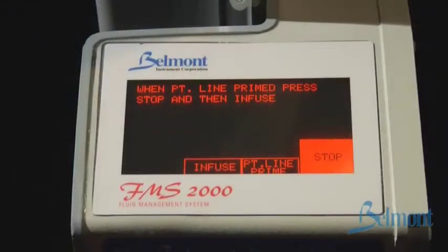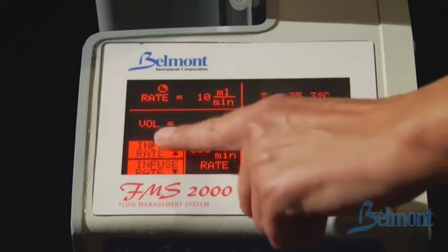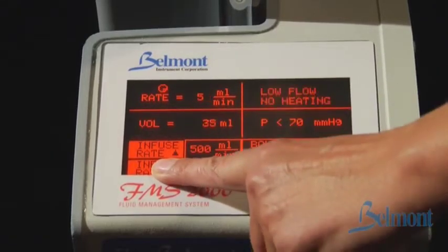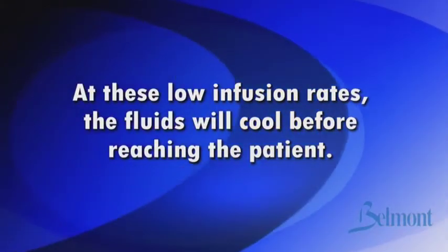Once the system is connected to the patient, press infuse to begin operation. Infusion will automatically start at 10 milliliters per minute. The infusion rate, total volume infused, temperature of the fluid being infused, and the pressure within the system are continuously displayed on the display panel. Press the up arrow to increase the infusion rate; press and hold to change the rate quickly. Press the down arrow to decrease the infusion rate. Note: at the infusion rate of 2.5 and 5 milliliters per minute, the fluids are not heated. At these low infusion rates, the fluids will cool before reaching the patient.